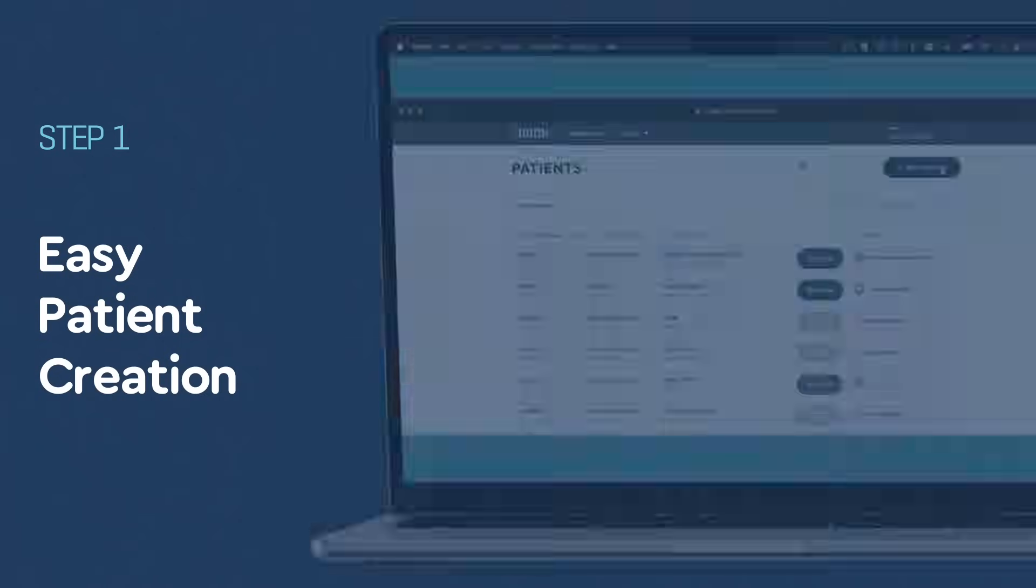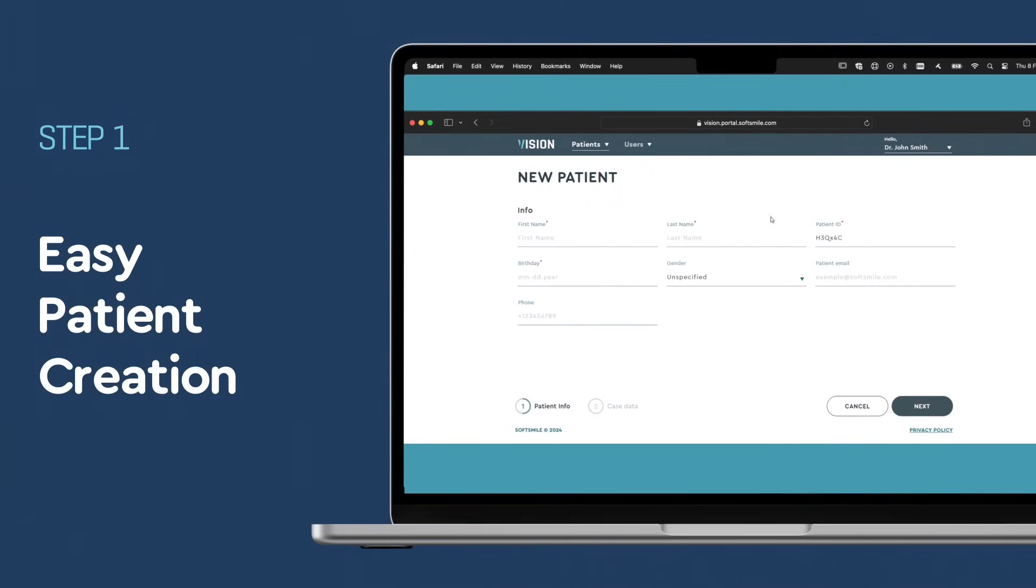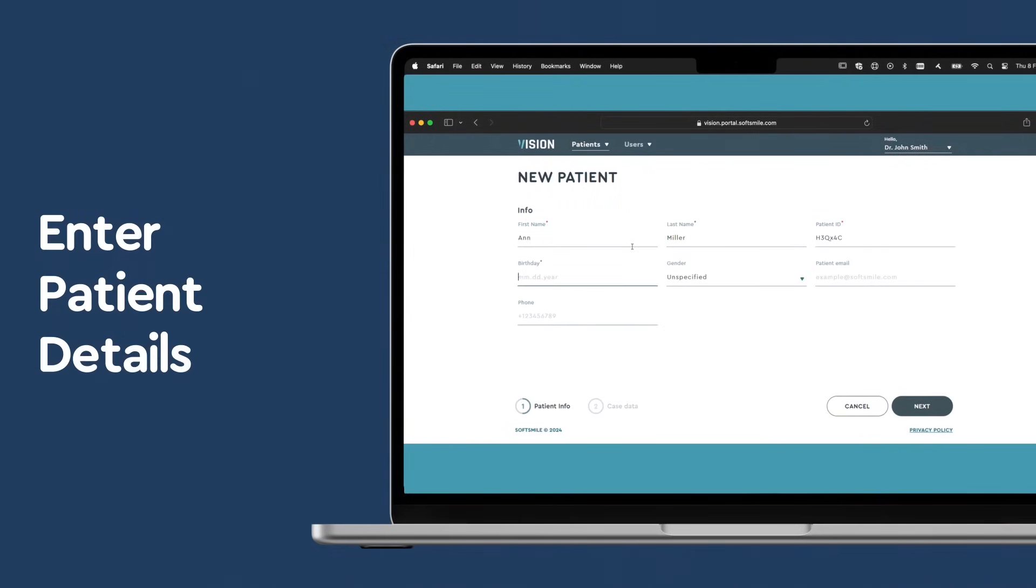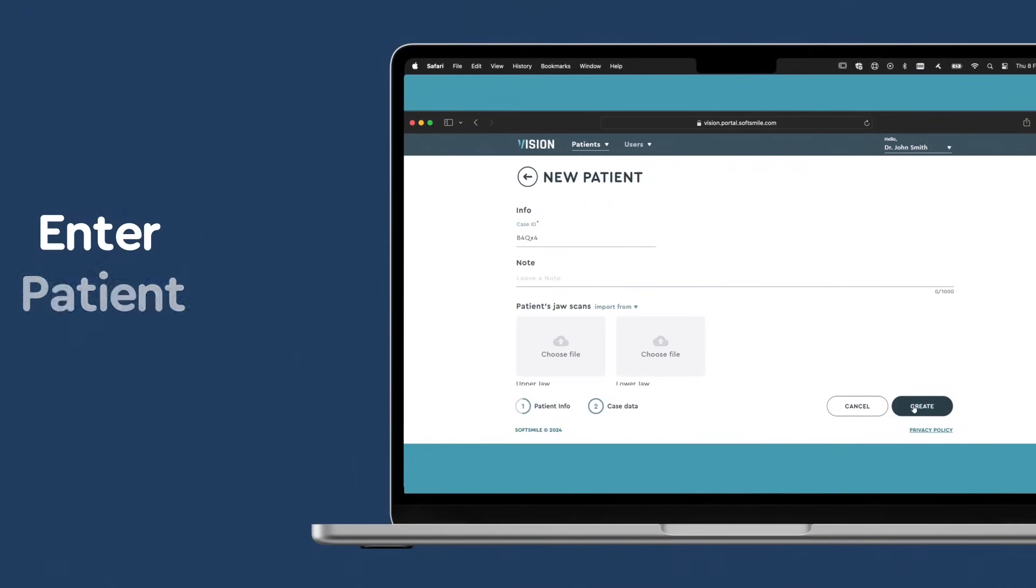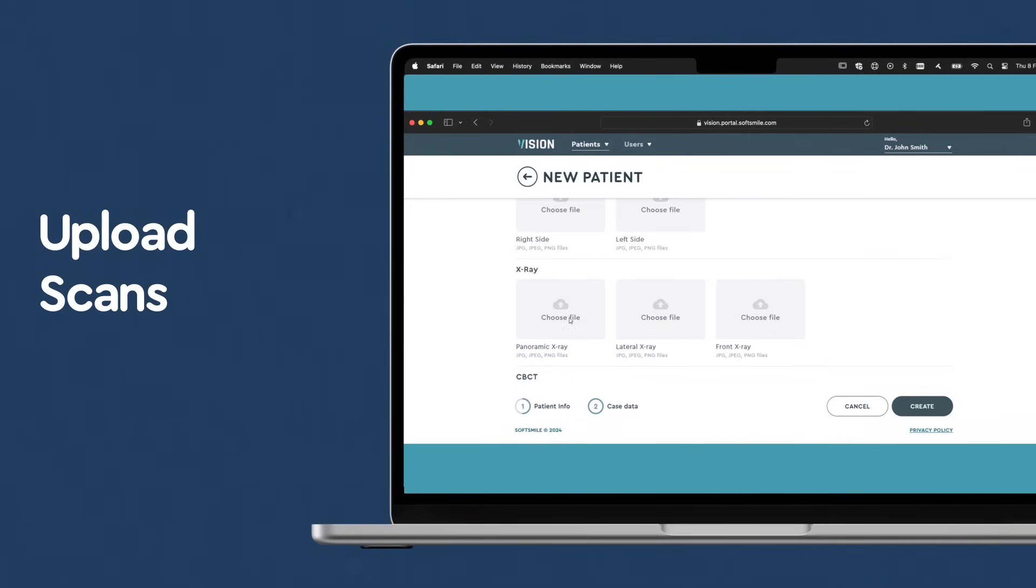Create a patient profile. Click Create Patient to enter the patient's details and tailor the treatment. After entering the information, click Next and upload the dental scans by selecting Choose File under the patient's profile.